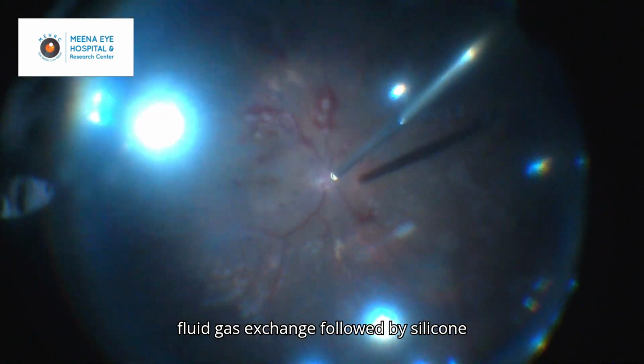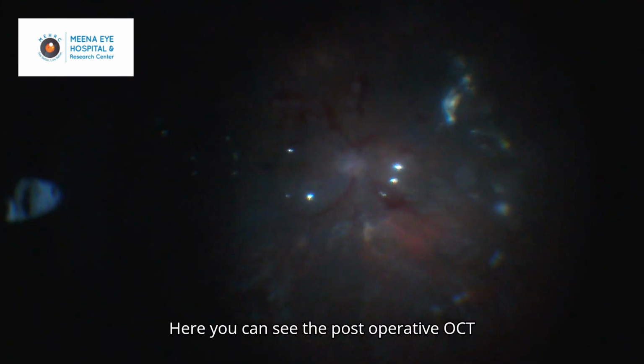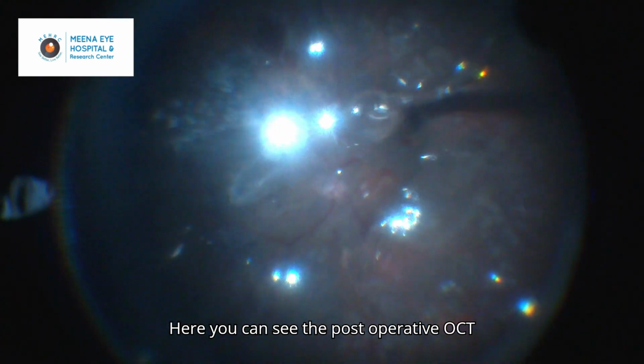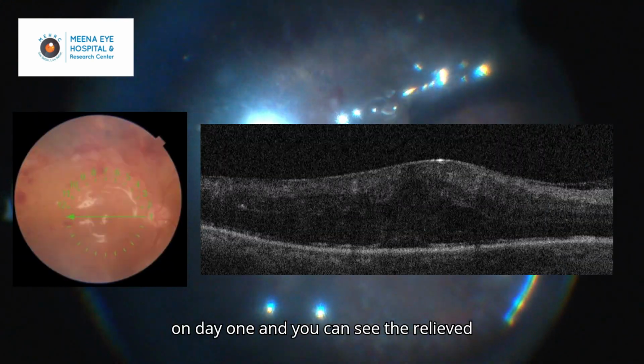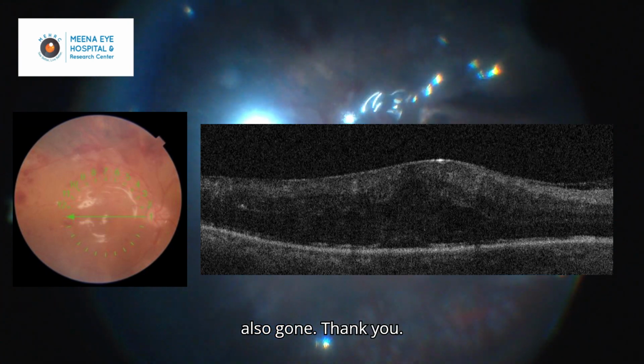So once the laser was done in all the areas, we finish it off with a fluid gas exchange followed by silicone oil injection. Here you can see the post-operative OCT on day 1, and you can see the relieved traction and the pull on the retina is also gone. Thank you.